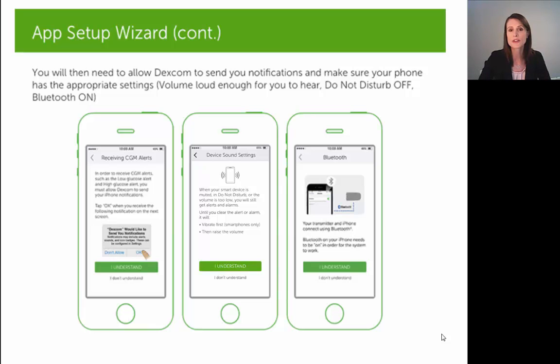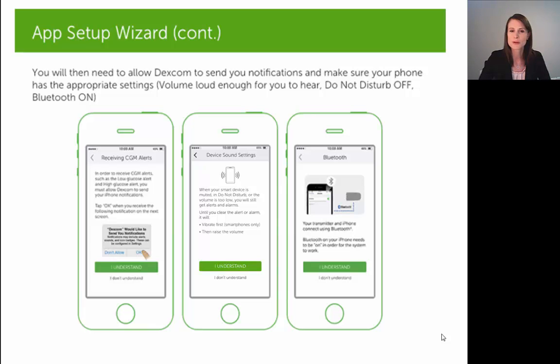The next screen will talk about how the alerts work on your G5 app. If you're using the newest version of the G5 app — version 1.5 — the alerts have the ability to override your phone settings. If your volume is set very low or you have the mute switch or do not disturb option enabled, the first alert you'll get is a vibration only. If you miss that and don't clear or silence it, it will result in an audible alert with increasing volume every five minutes until you clear or silence the alarm. You may want to check what version of the app you have to confirm your alerts will work that way.